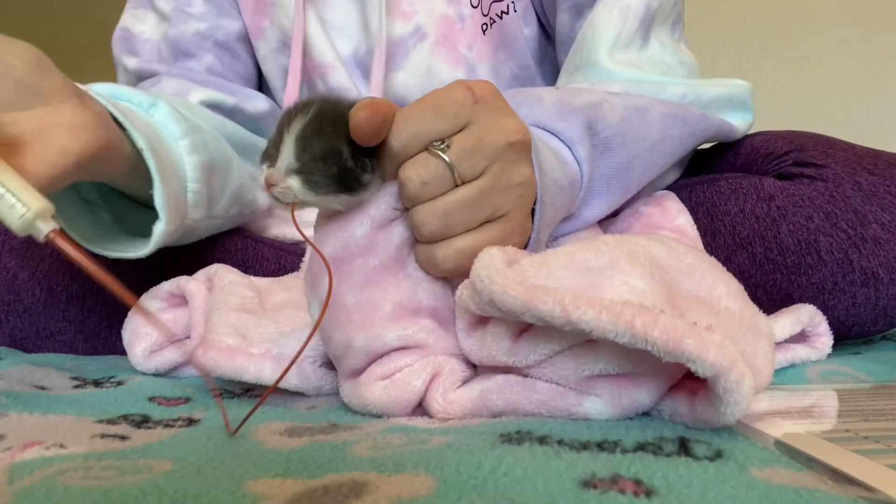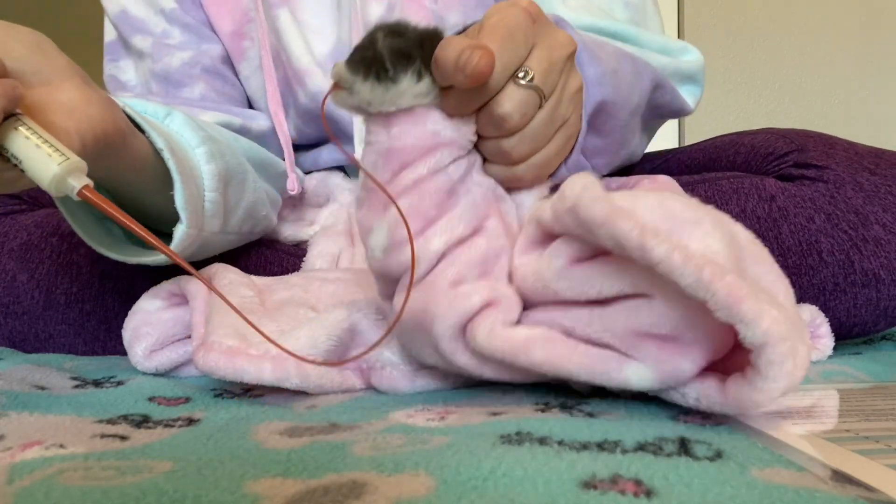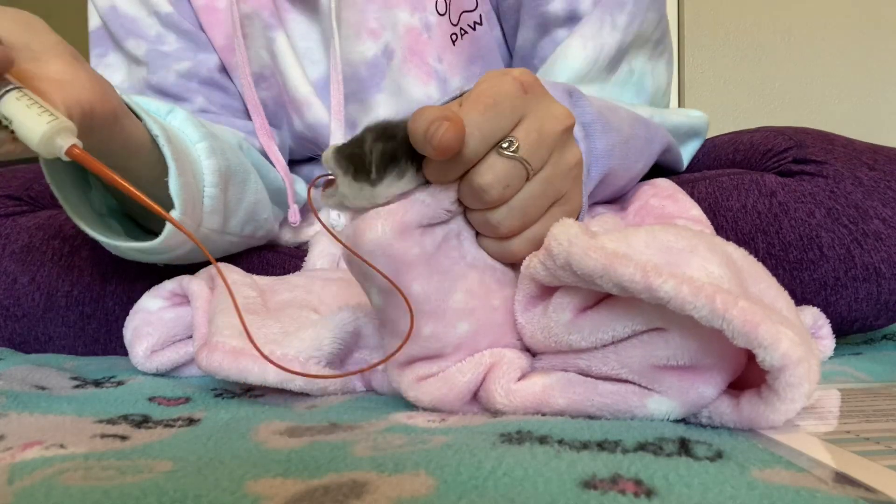I am making sure that that black mark that we put on the tube is at the entrance of the kitten's mouth. And now I am slowly syringing the milk into Mouse.